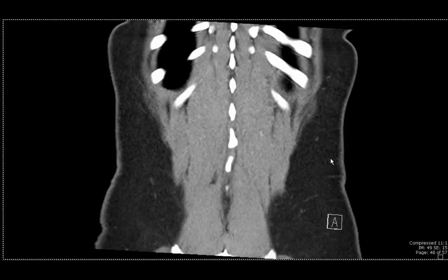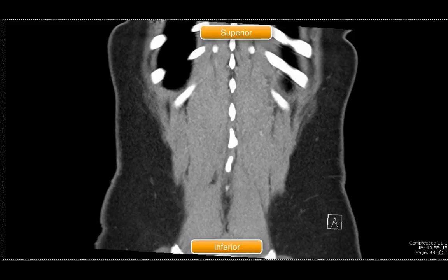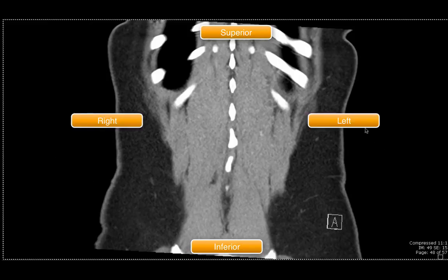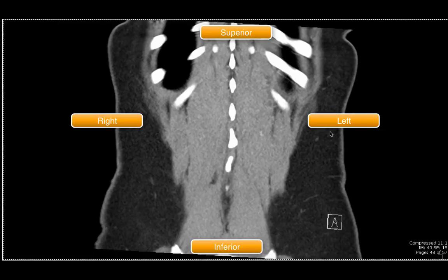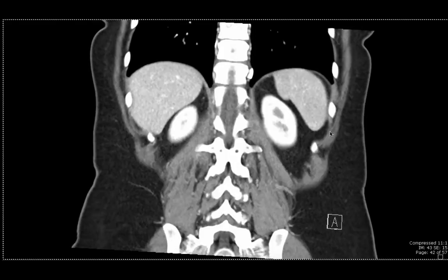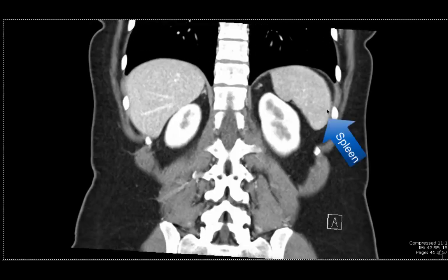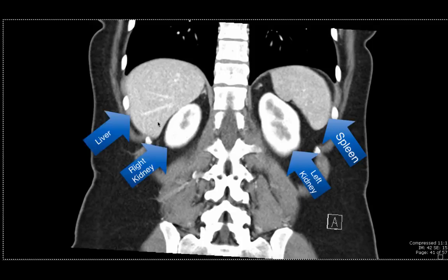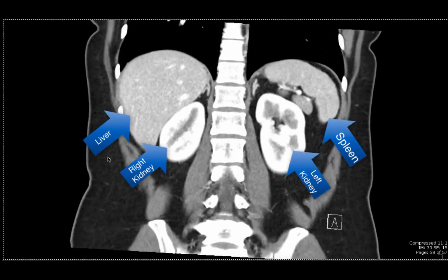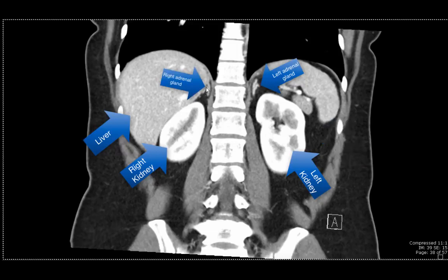We'll now showcase some of the same anatomy in the coronal plane. To orient everybody: in the coronal plane, up here is the head of the patient, down here is towards the feet, this side is the right side, and this side is the left side. We start by scrolling from posterior to anterior — you know your posterior because you can see the lumbar and thoracic spine vertebral bodies. As we scroll anteriorly, one of the first organs is the spleen in the left upper quadrant. Adjacent to it is the left kidney, and on the other side of the spine is the right kidney with the liver right above it. The adrenal glands are also visible — this triangular-shaped structure on top of the left kidney on the left and on top of the right kidney on the right.